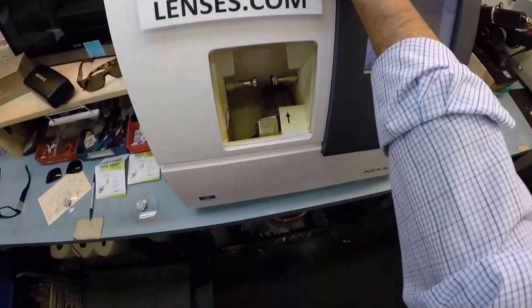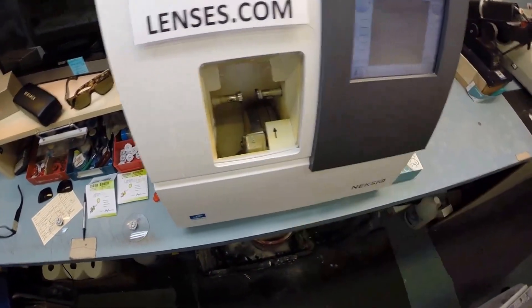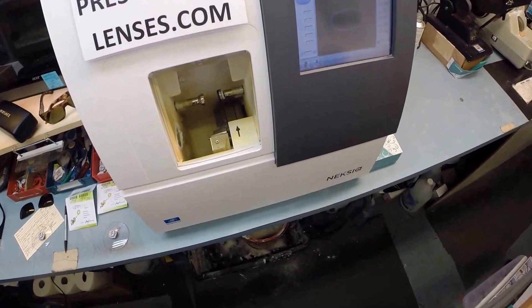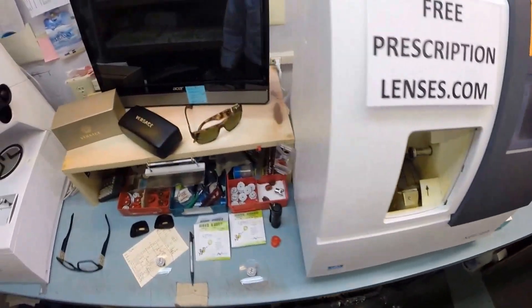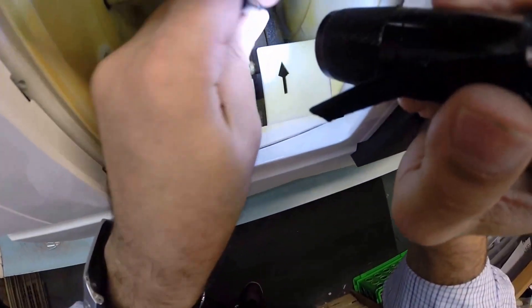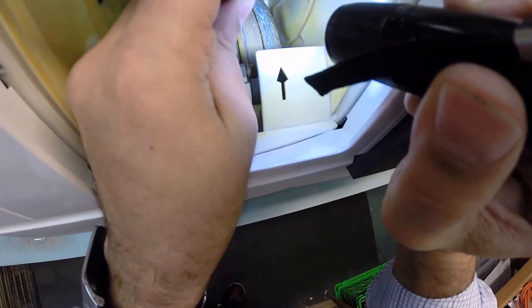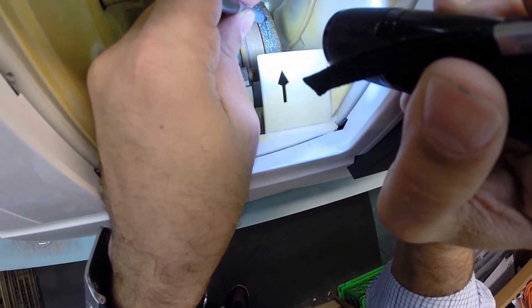Now this is the edger. This is what costs forty thousand dollars and weighs 200 pounds. I recommend everyone go out and buy their own and put it on your kitchen counter. Then you won't need me anymore to make your glasses—you can do it at home. The actual cutting wheel is over here on the far right.